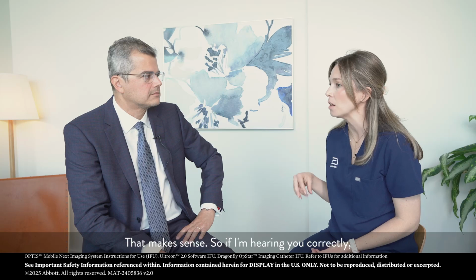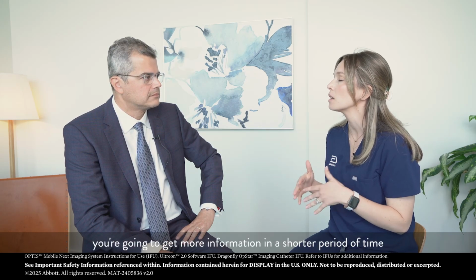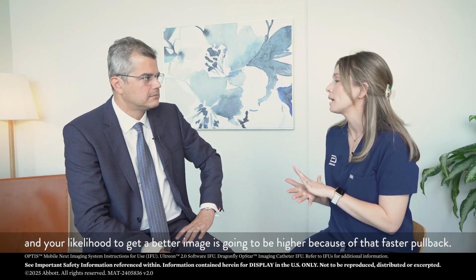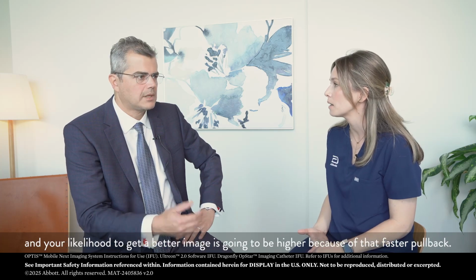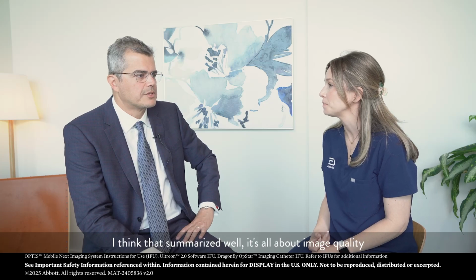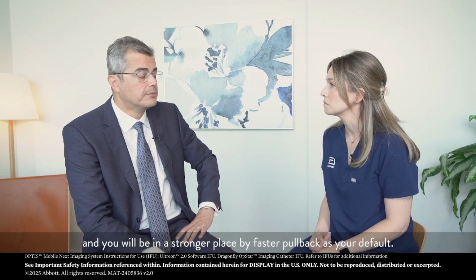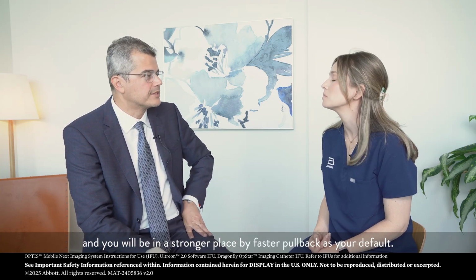So if I'm hearing you correctly, it sounds like with the 75 millimeter pullback, you're going to get more information in a shorter period of time, and your likelihood to get a better image is going to be higher because of that faster pullback. I think that summarized well. It's all about image quality, and you will be in a stronger place by faster pullback as your default.